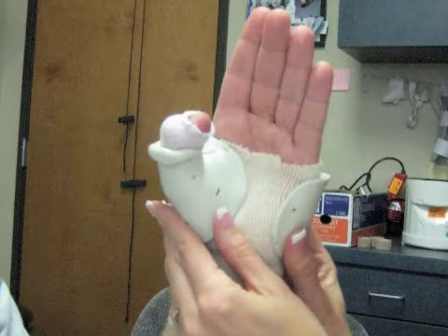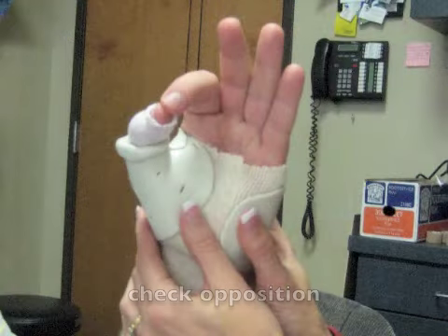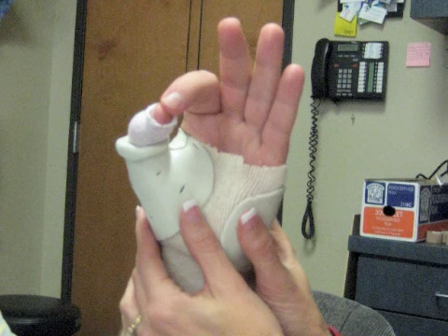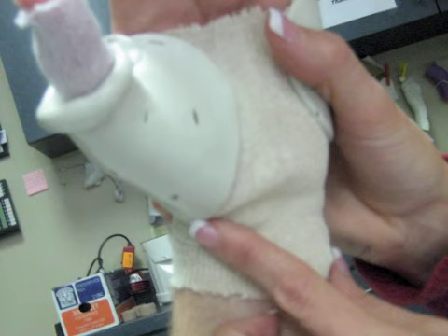Depending on the condition, you may need to roll down the material around the thumb to allow IP flexion. If indicated, roll down the material around the thumb and ask the person to bend their thumb and make sure that they can do so comfortably. Then ask the client to touch the tips of each finger to the thumb to make sure that they still have functional use of their hand while wearing the splint. Make sure the client can perform radial and ulnar deviation with no impingement from the splint on the wrist. Ask the client if the splint is comfortable and trim as needed.